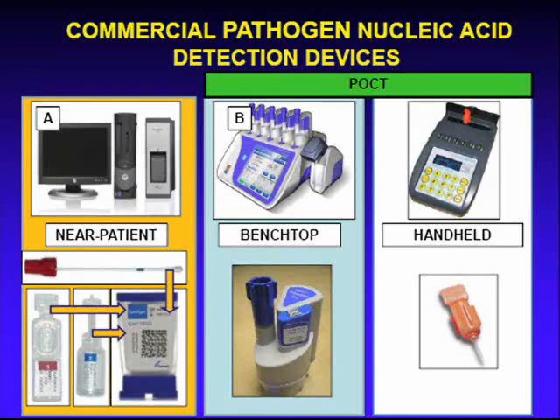But in the case of what's out there, we have a newer generation of the handheld nucleic acid analyzer that I described previously. It's shown here on the far right. This is now based off the same technology from a company called Smith's Detection. This instrument still uses markers for biothreat agents, so it targets Bacillus anthracis, Francisella tularensis, as well as Yersinia pestis.